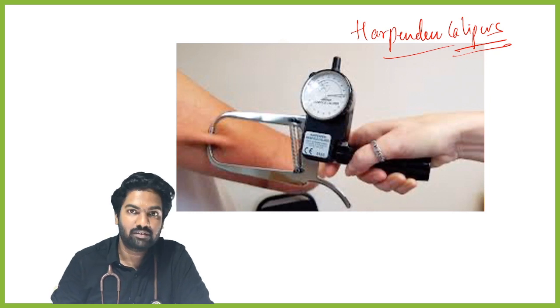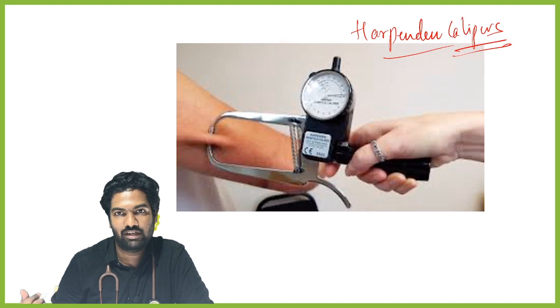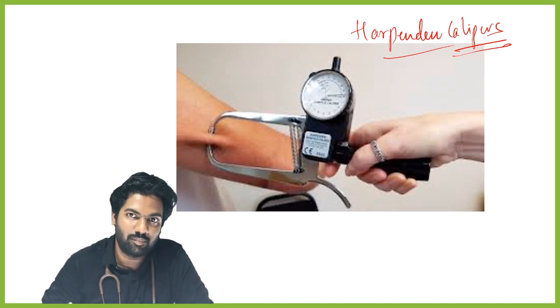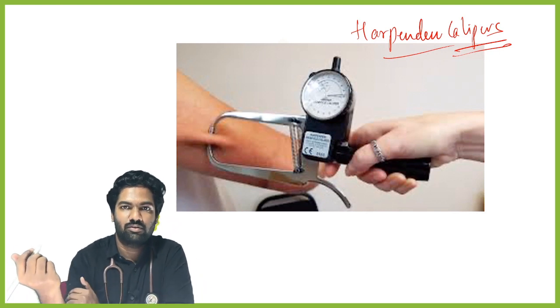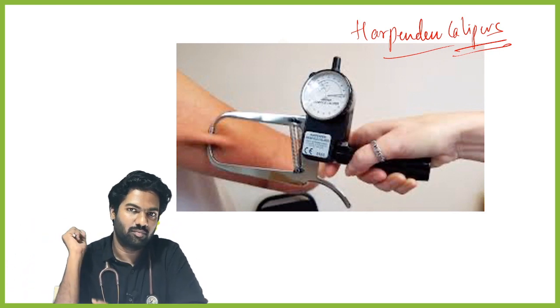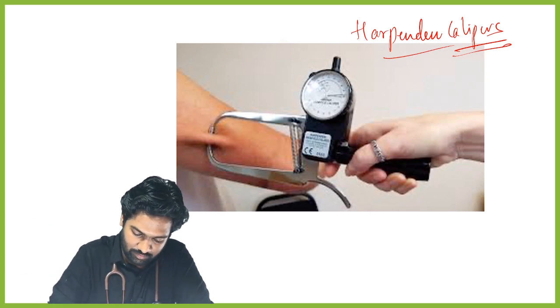What are the areas where we want to know the skin fold thickness, by which we can comment on the nutrition of the child? First and foremost, you can use it on the biceps, then triceps, back. This is where we are using skin fold thickness.